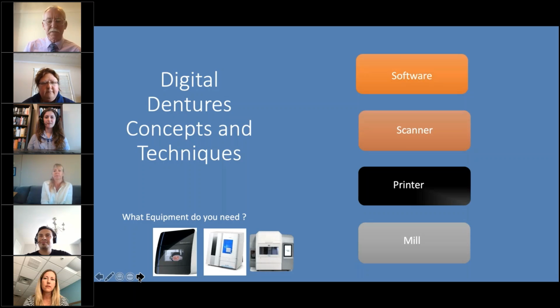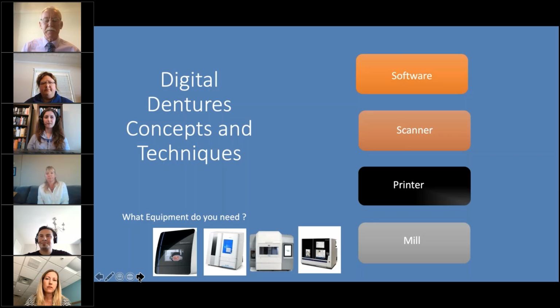If you're a crown and bridge lab doing a bit of pros work and milling the odd splint, very, very good. But if you're a high volume laboratory, you want a more solid mill like the PM7 and the IMES iCore. Those are probably the only 2 mills I would recommend if you want to get into volume. That's the Ivoclar PM7 and the IMES iCore. There are other mills out there. Zirkonzahn is another great mill, but I haven't had any experience with that, so I can't comment.